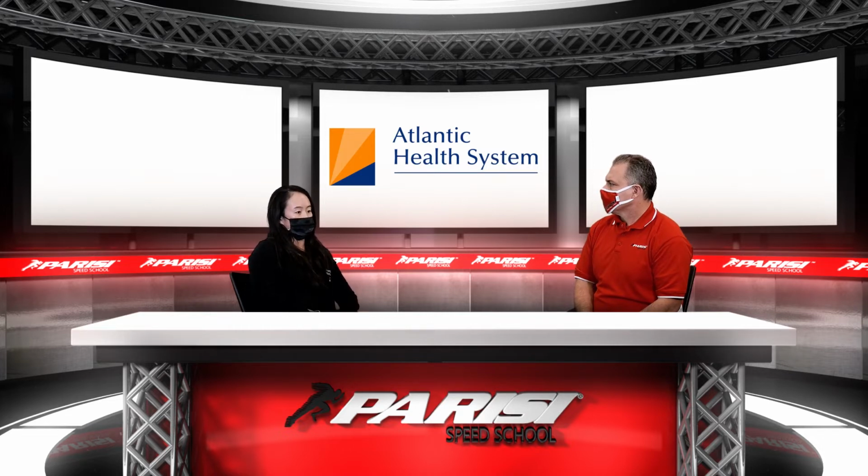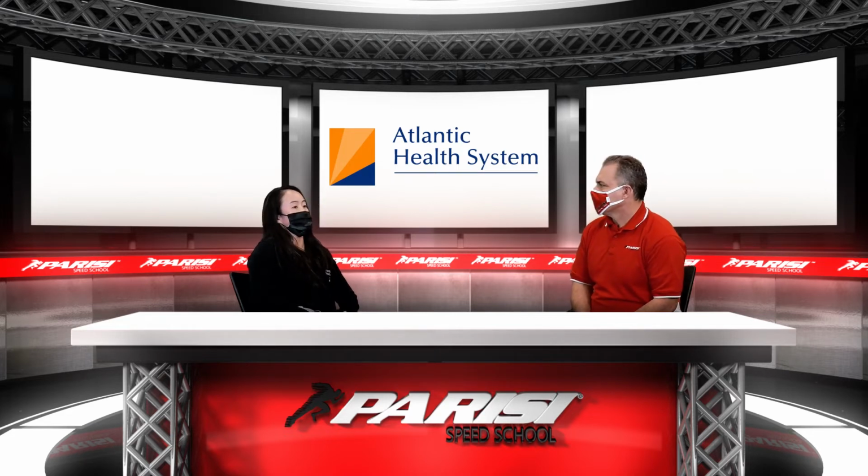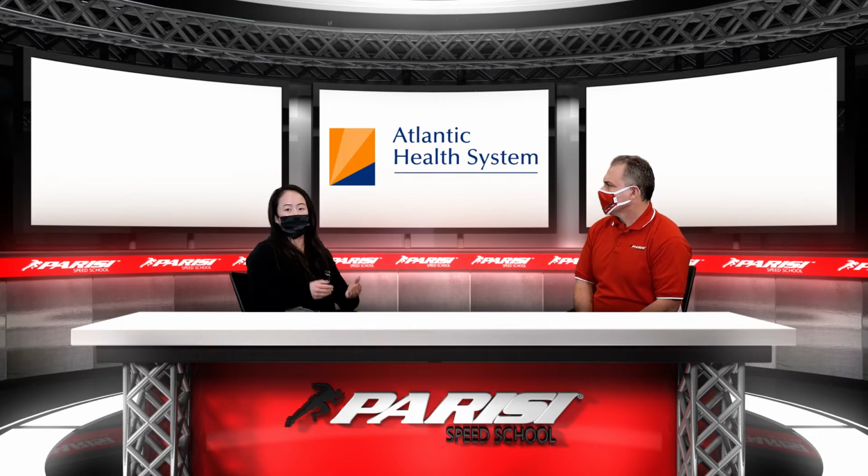So what this test does, it measures your VO2 max, and that is the best index for determining what your work capacity is, or in other words, your aerobic fitness capacity. And the higher this value is, the higher your VO2 max is, the better shape you're in, aerobically speaking.